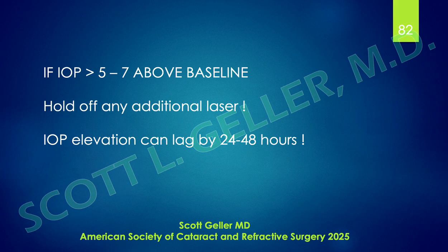And understand also that intraocular pressure elevation can lag by 24 to 48 hours. I have seen that. If you have a patient come in with relatively normal intraocular pressure, let's say they came in with a baseline of 15, 17, 18, 19, maybe 20, and they come back after your procedure and they have a pressure of 25, 27, just tell them you have to hold off.